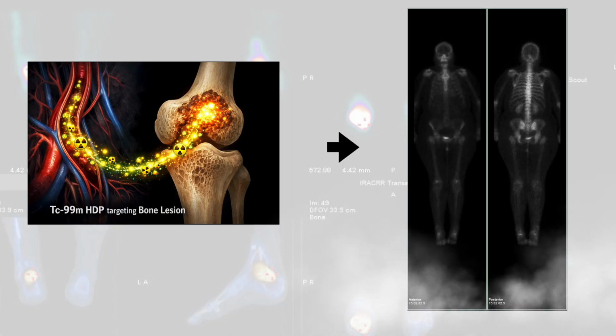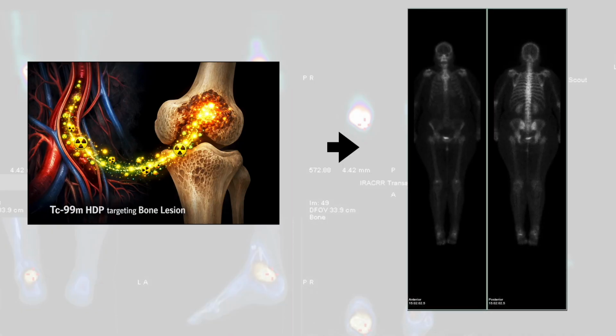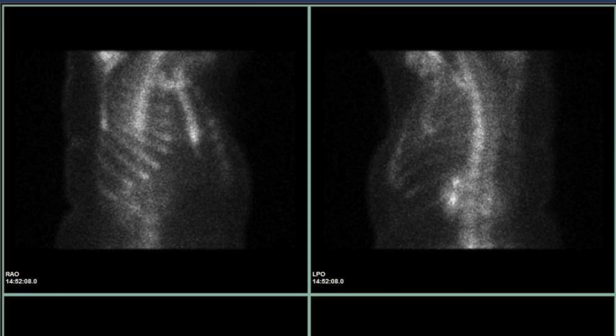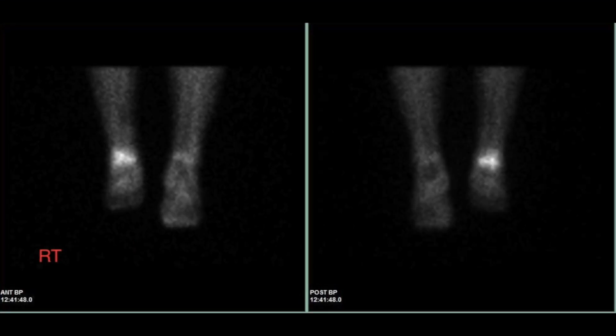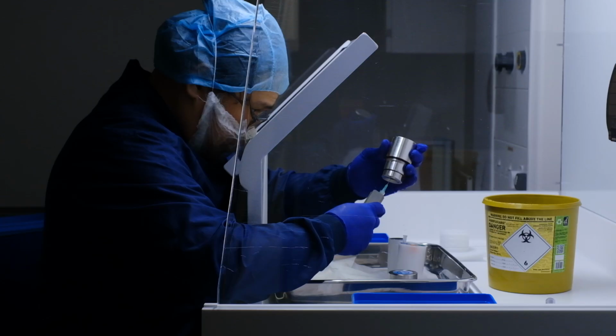With a tagged radioactive tracer, it can now be detected by the gamma camera. It is expected that the tracer will be absorbed by the bones. If there is any condition or pathology present, it may be demonstrated by increased or decreased uptake, increased vascularity, and increased deposition of the tracer in the tissues during the blood pool phase.